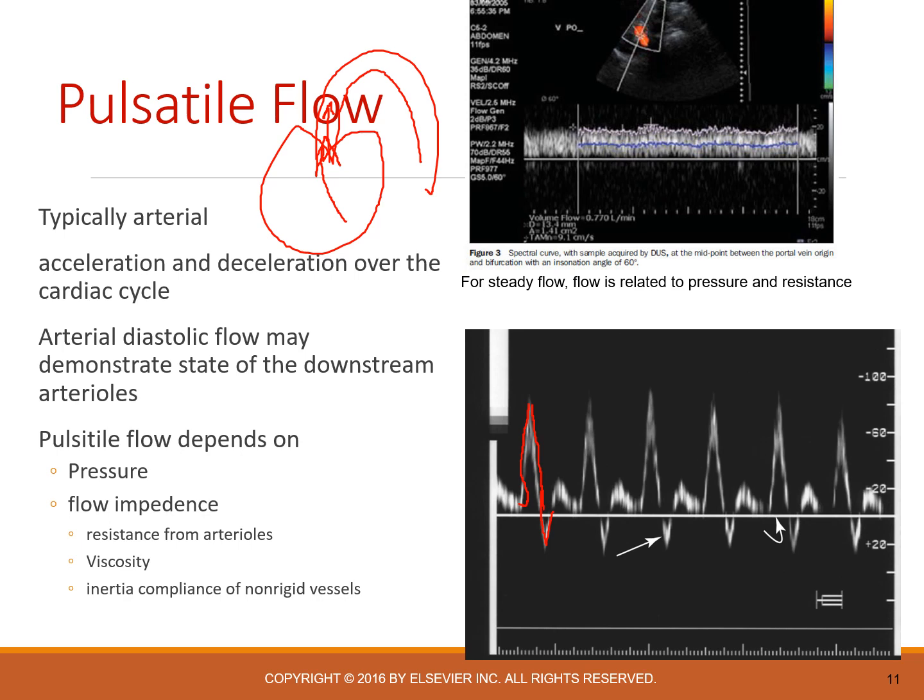It pushed all the way through systole. As the heart starts to relax, something up ahead pushes back hard enough that the blood actually moves back a touch. We call this early diastolic reversal. That blood is reversing in the system.